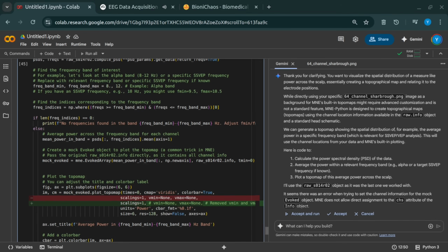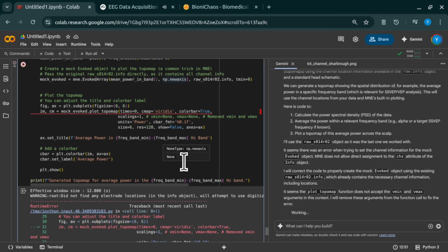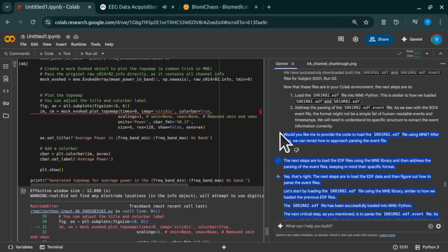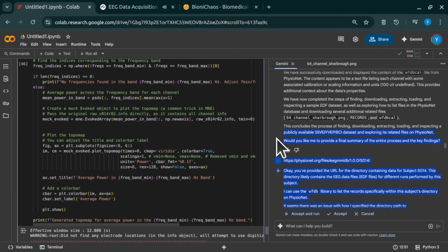Okay, so roadblock. How do you tackle something like that? Where do you find the key? The first port of call, always, is documentation. You hunt around the source. So back to the PhysioNet website for this dataset, the EEG MMIDB, looking for any description of the .event file format. That's the detective work part of data science, isn't it? It really is. Sometimes the info is right there, sometimes it's buried, or, well, sometimes it's missing.